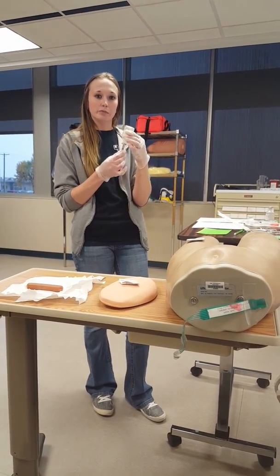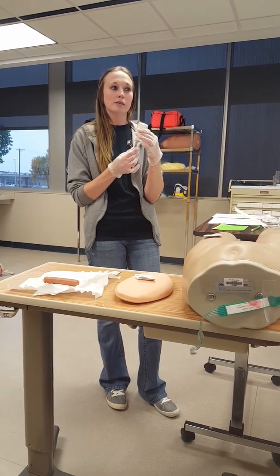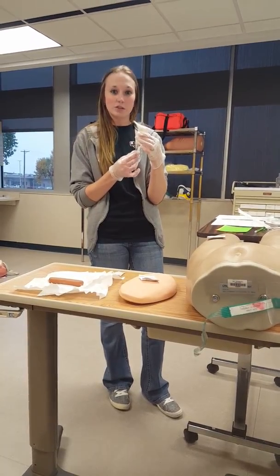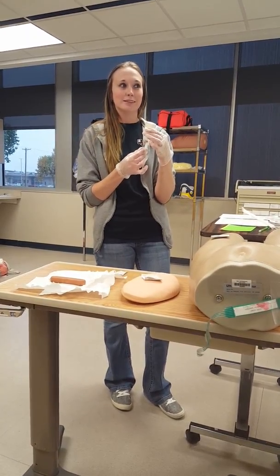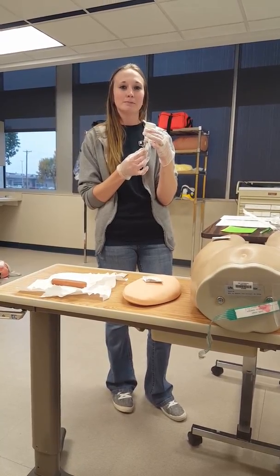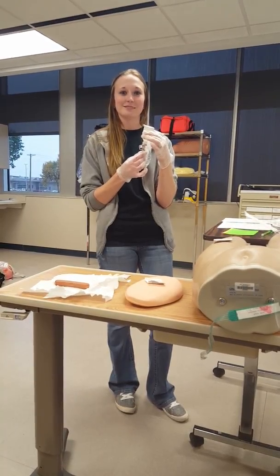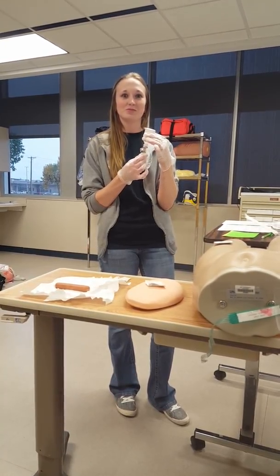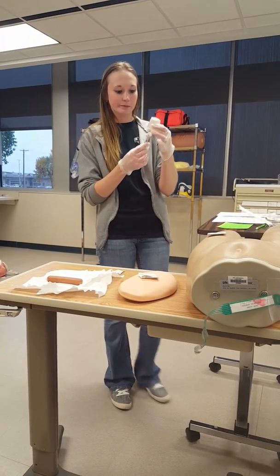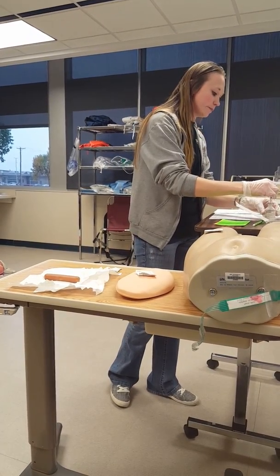So the right patient, right route, right time, right dose, and the last one is right med. So then I would put up the vial.